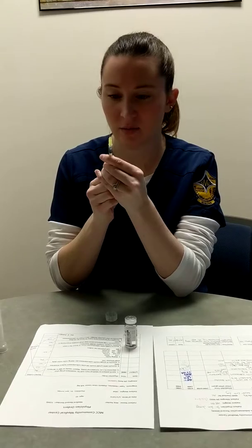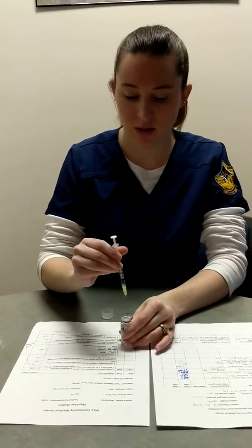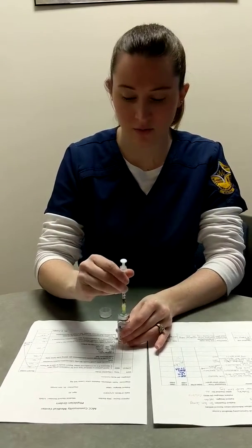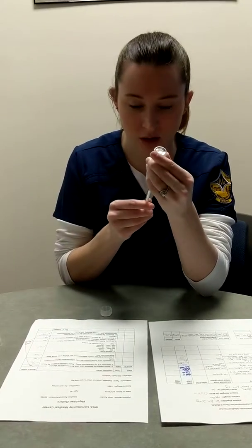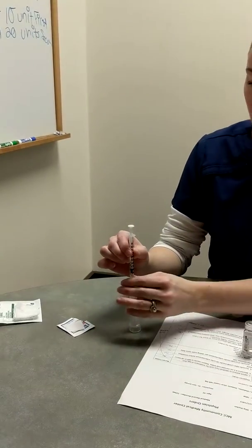We're going to draw up the air that we would need, and this injection calls for 0.1 mLs. We'll draw that much air, which we got. We insert it into our vial, inject our air, and then withdraw our solution. Make sure that we have no bubbles. And then we want to carefully recap this one and bring it into the patient's room.